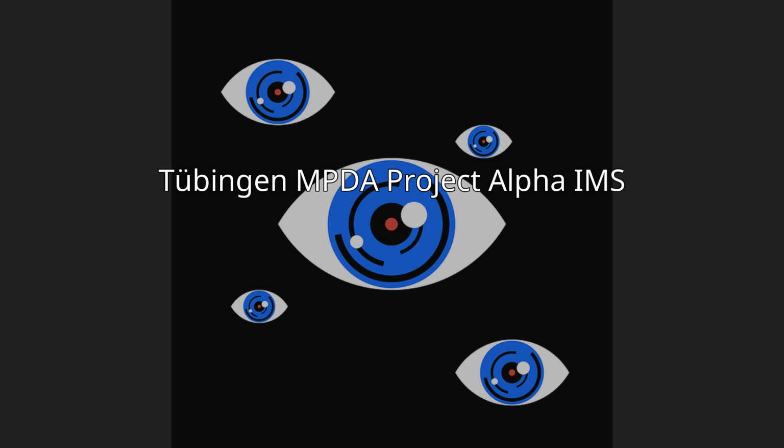Tübingen MPDA project, Alpha IMS. A southern German team led by the University Eye Hospital in Tübingen was formed in 1995 by Eberhard Zrenner to develop a subretinal prosthesis. The chip is located behind the retina and utilizes microphotodiode arrays, MPDA, which collect incident light and transform it into electrical current stimulating the retinal ganglion cells. As natural photoreceptors are far more efficient than photodiodes, visible light is not powerful enough to stimulate the MPDA. Therefore, an external power supply is used to enhance the stimulation current.